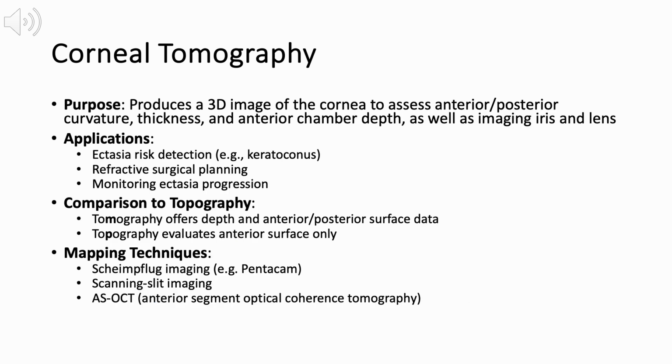Corneal tomography is a non-invasive imaging technique that generates a three-dimensional image of the eye, allowing for detailed assessment of both the anterior and posterior corneal curvature, corneal thickness, and anterior chamber depth. It also provides structural imaging of the iris and lens, making it a powerful tool in comprehensive anterior segment evaluation.